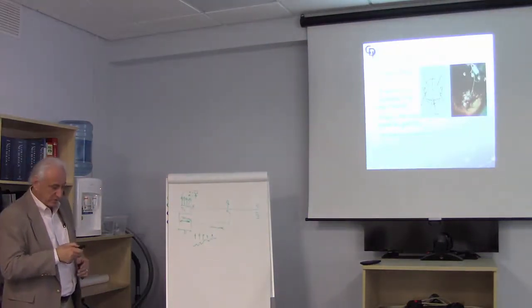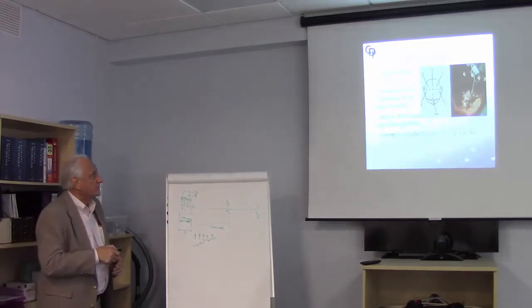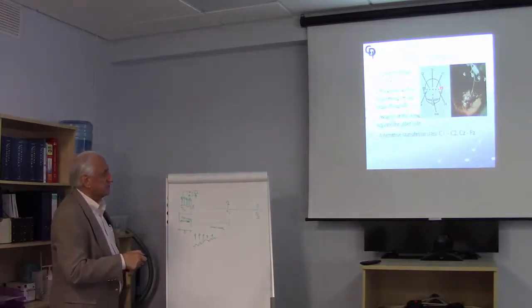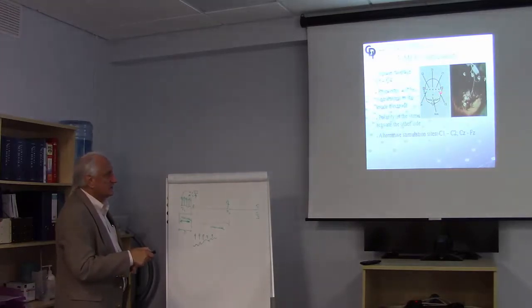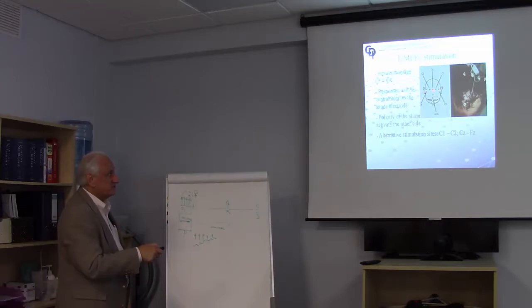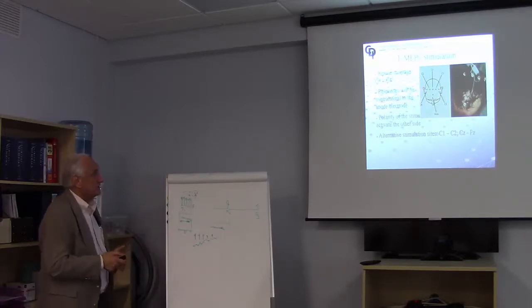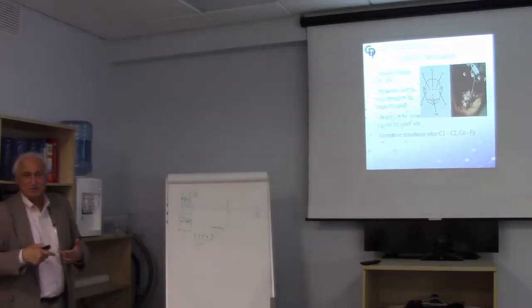Okay, just to review where you stimulate. We stimulate between C3 and C4. If you remember, we didn't spend a lot of time on this, but the 10-20 montage, the line through the vertex between the auditory meatus, defines where that plane is, and C3 and C4 are on the more lateral edges of that plane. People will sometimes put electrodes all the way across that plane, and they'll put on some other ones. We get pretty good results just keeping it at C3 and C4.